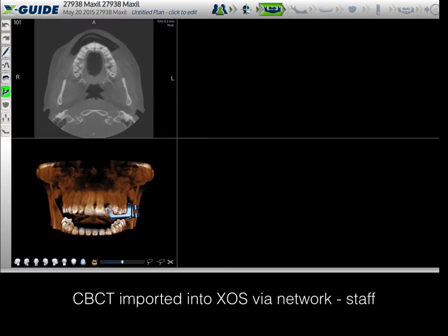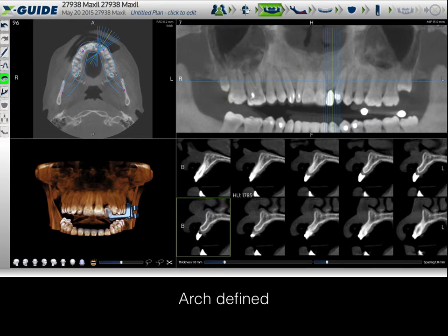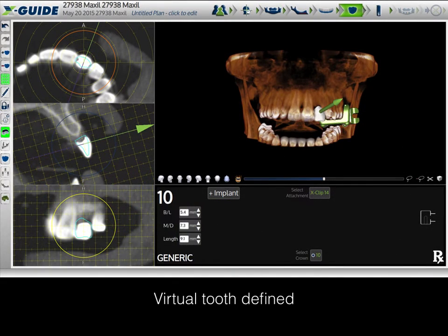The staff is going to map the arch form by clicking on three locations — number two, number eight/nine region, and number 15 — and the XOS software will automatically map the arch, which can then be finalized by the doctor or staff. The next step, if desired, is to place a virtual tooth. When there is no imaging guide, I'll have my staff place a virtual implant at the contralateral site — in this case number seven — to measure the ideal size of the actual tooth and then duplicate that with a virtual implant on the other side.